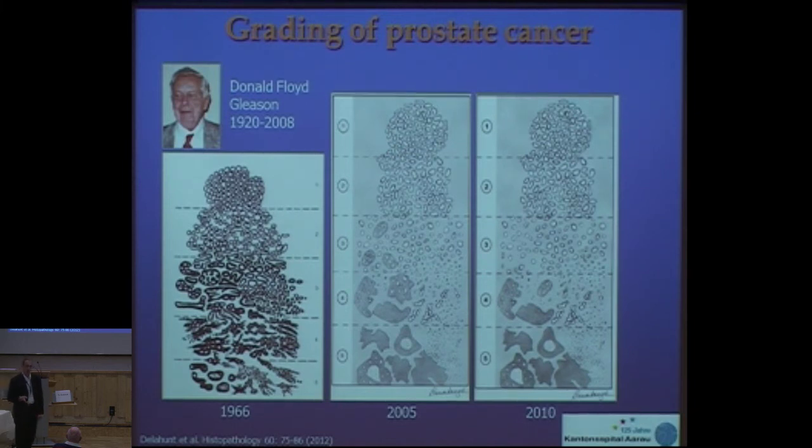In fact, when you look at the pictures in the old textbooks, you see a picture of a 1+1 Gleason cancer, and look at a later textbook, you see the same picture, and it's got a Gleason score 1+2, and you look at another later textbook, you see exactly the same picture, it's got already a 2+2 or 2+1. So things change, and it's all man-made, and we should keep this in mind.